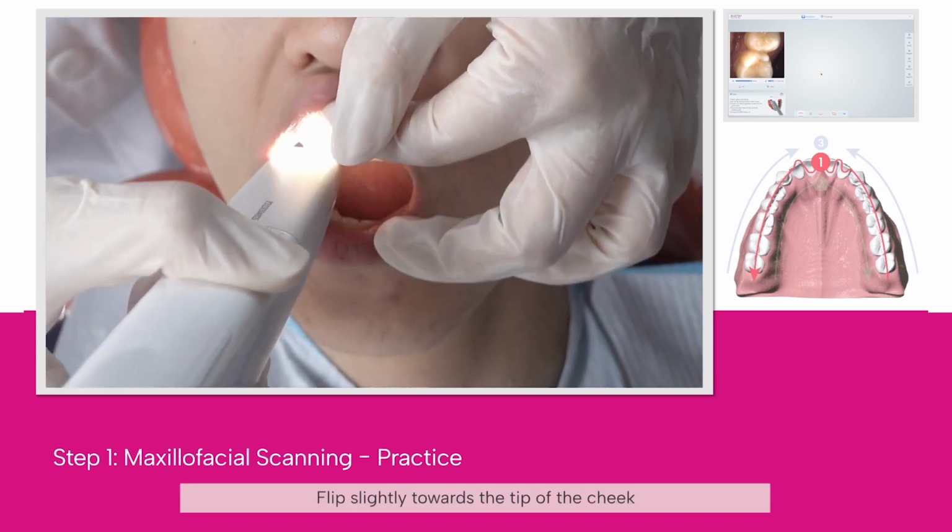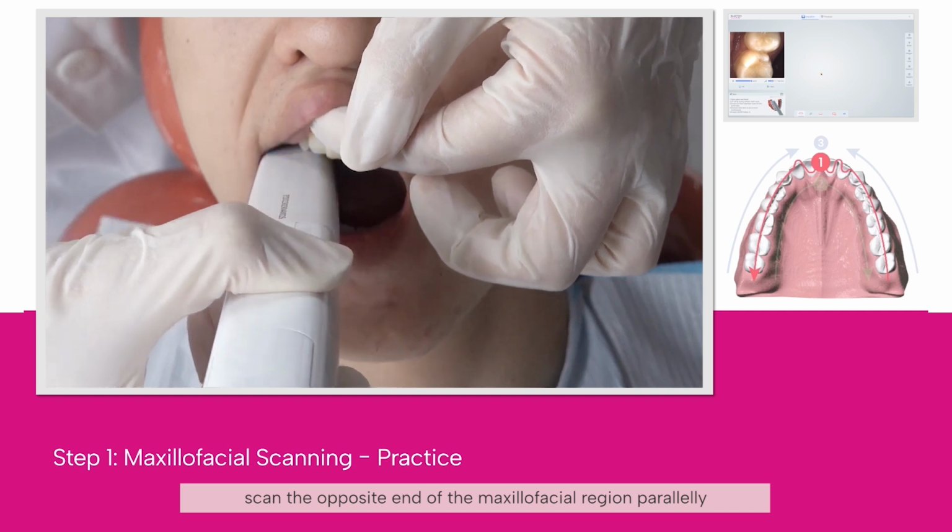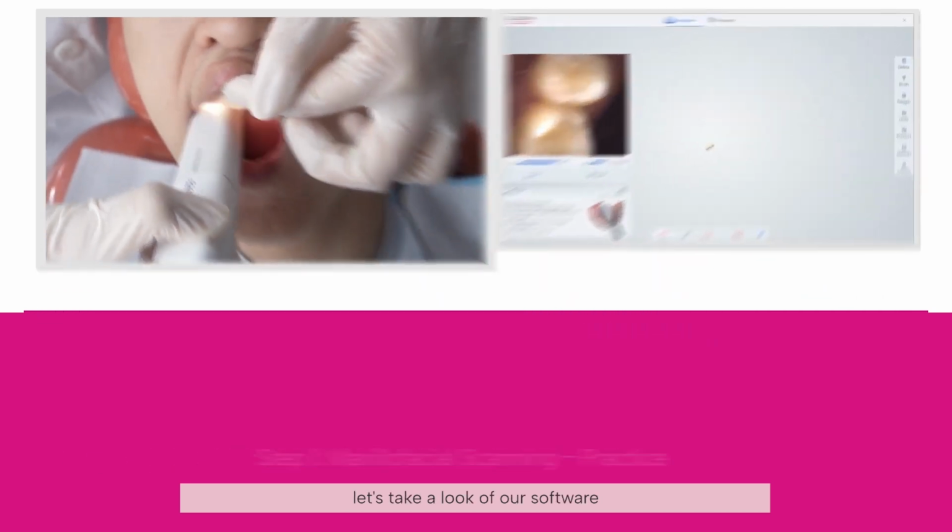Flip slightly towards the tip of the cheek, and after flipping, scan the opposite end of the maxillofacial region parallelly. Let's take a look at our software.